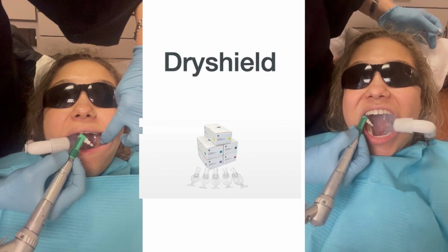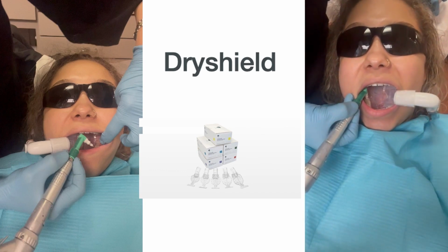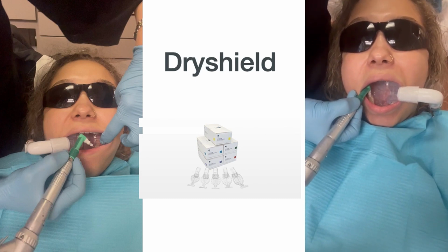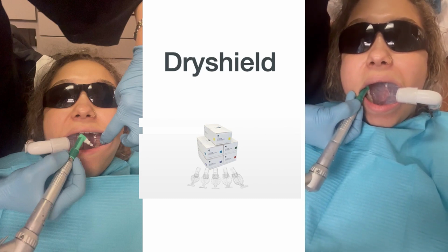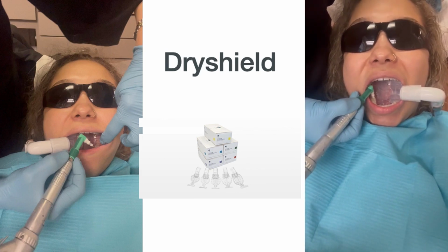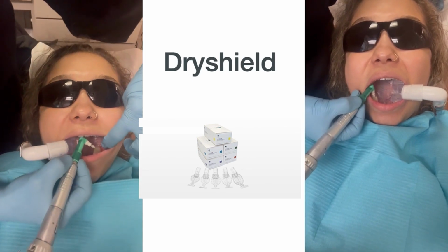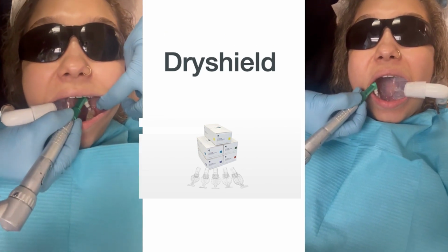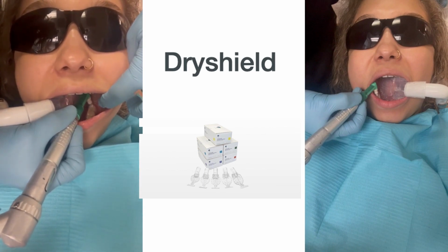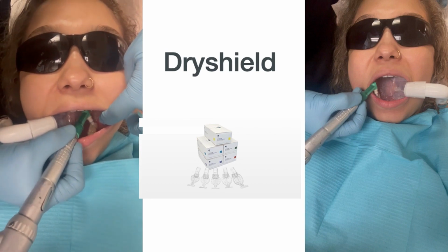I was basically getting her ready to repair two sealants. And, you know, that patient cooperation is very, very important. And again, thinking about explaining things to the patient, and most importantly, going back to lubricating it, making sure that it's wet, because that was something that, again, one of my team members didn't do. No matter what side you're on, you really had good visibility, again, and were able to maneuver back and forth. So that's the Dryshield.